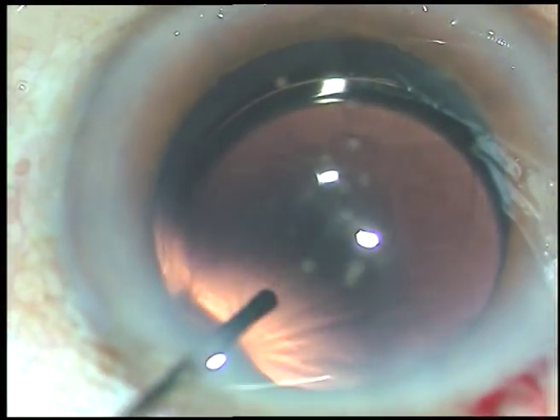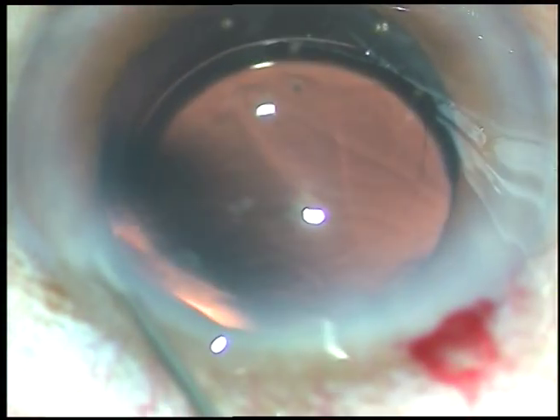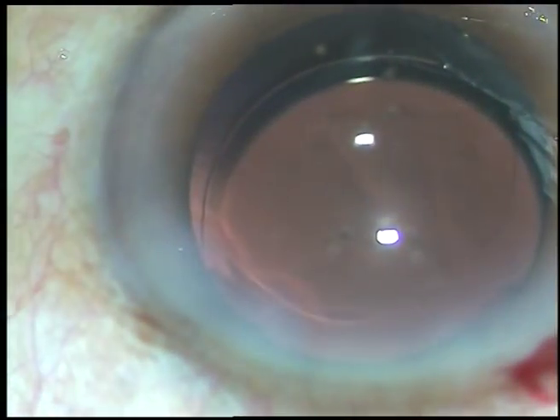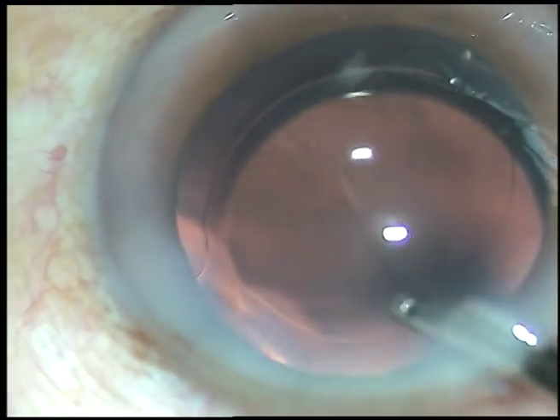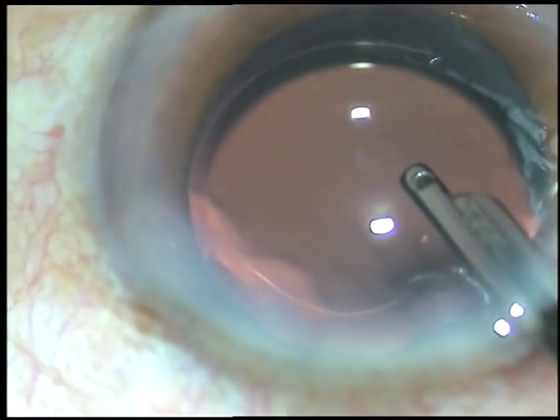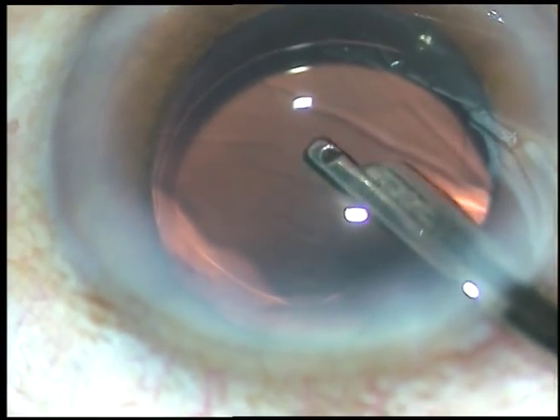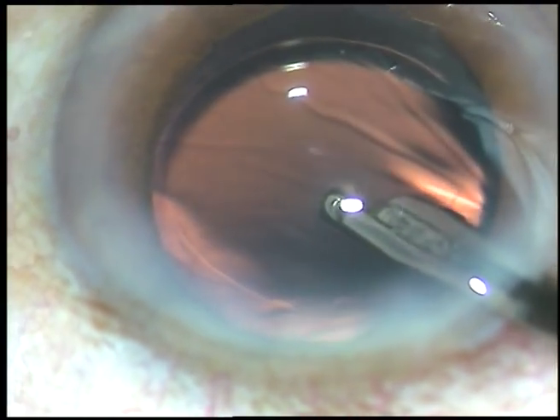This is a bit of moxifloxacin. Now hydrate the stroma on either side of the paracentesis so that this stab wound becomes waterproof. This is the final lavage of the anterior chamber — this is very important. Remove whatever you have used and leave only pure BSS; this will eliminate the risk of toxic anterior segment syndrome. TAS will never occur.